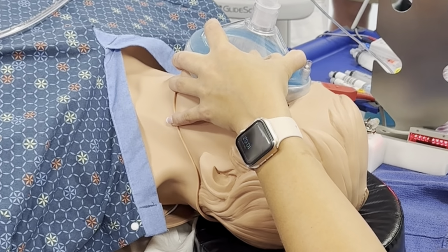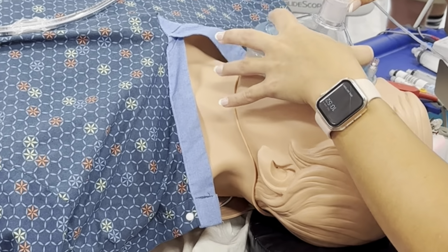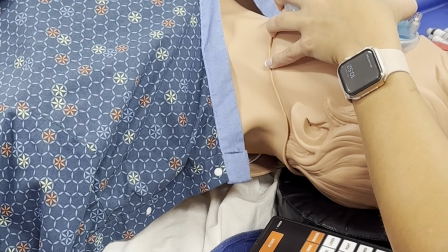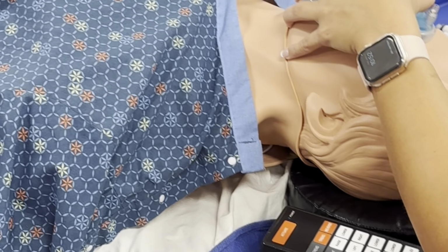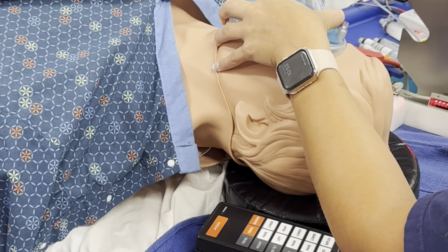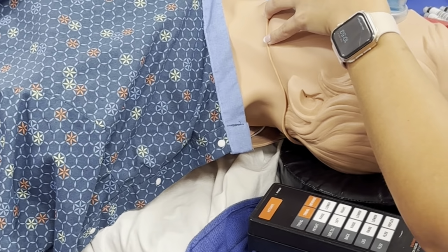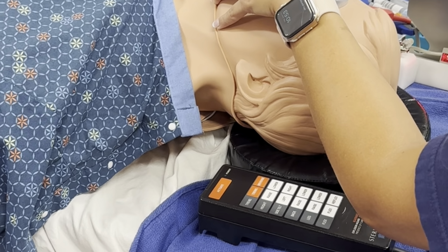And you can see that on your end tidal, you're not getting any end tidal. Right, you see the end tidal is 0. There's nothing coming out because the patient isn't breathing anything off. So now I'm gonna breathe for the patient. So we're gonna add a little bit of pressure support, and I'm gonna give breaths for the patient. And you wanna look at your tidal volumes and your end tidal CO2 to make sure that you're breathing for the patient. So on a real patient, you would see fog in the mask, because it's hot air. You would see end tidal, you're getting a waveform there, and she's off.